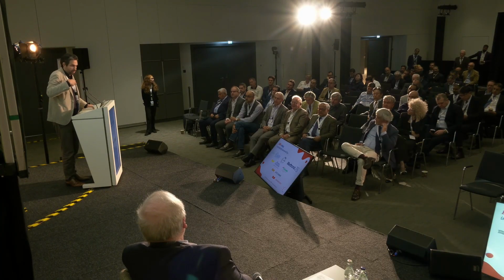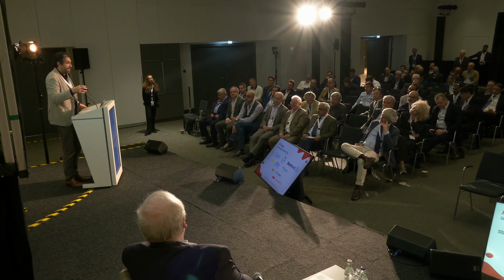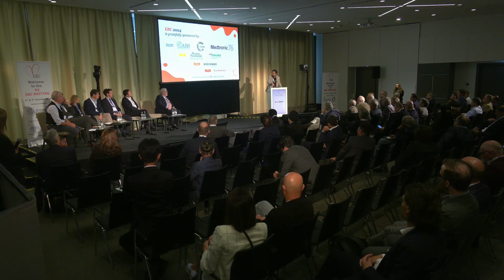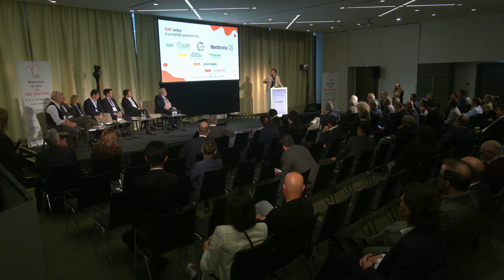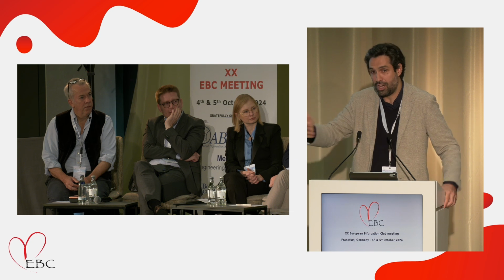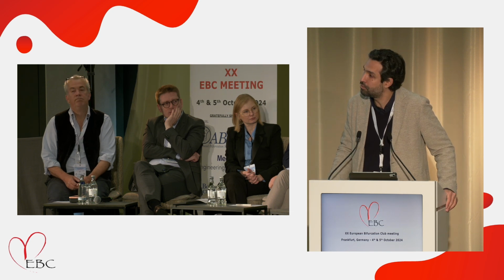That's the reason when you go to our courses on CT-guided PCI, you have to look at the images, because the radiologists have never put a stent before. You are the one putting the stent, so you need to know where the calcium is and how the calcium is. Now, I will tell you right away, you will not need to open the PACS. All this information, this DICOM, will be processed in 2 to 5 minutes, and you will get all the three-dimensional information, which will make your life extremely easier. And that is not the future. That is happening in the trial. And this will be available as soon as the evidence is collected to support it.